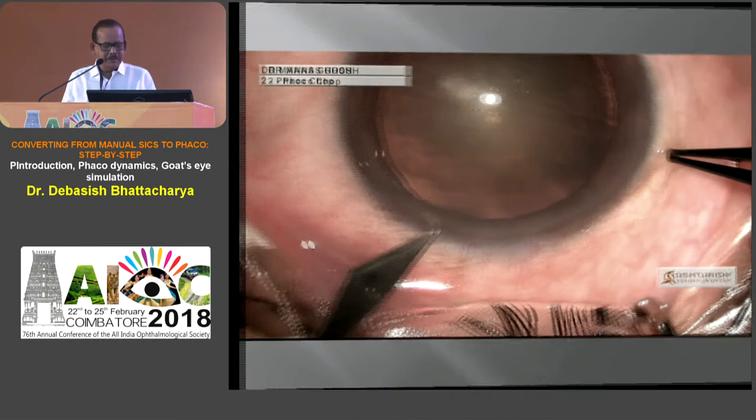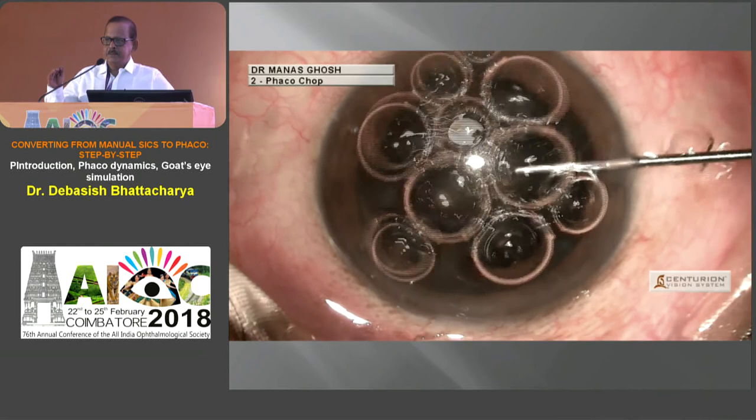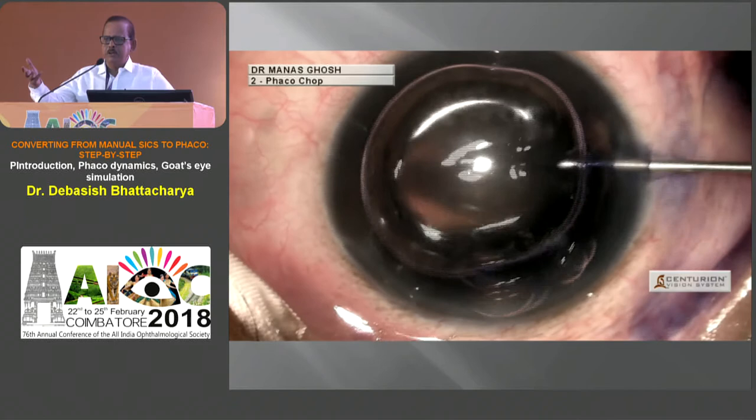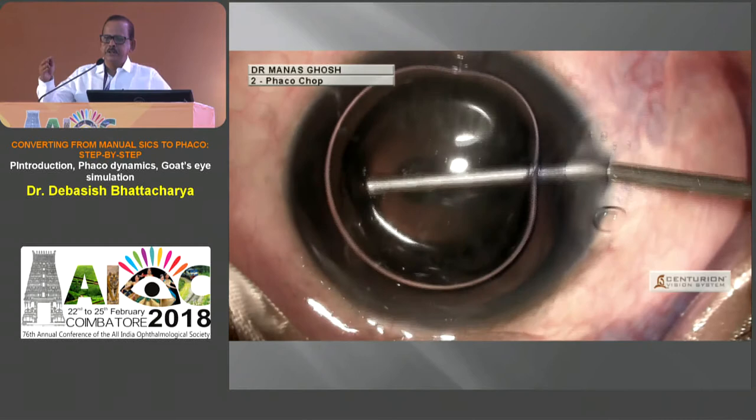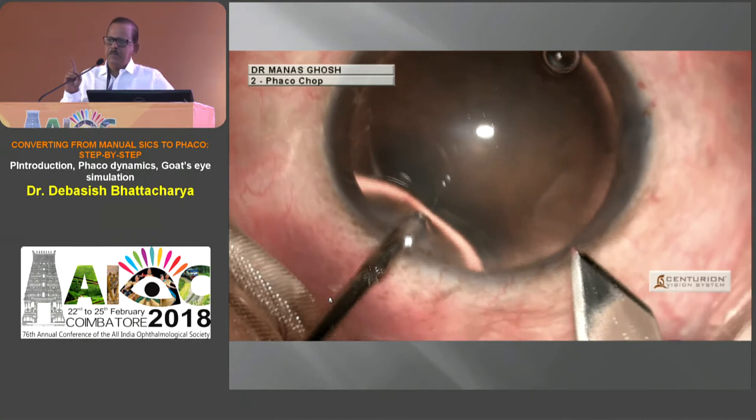Let me take you through the preliminaries of the steps of learning. Initially, do all cases planning SICS in mind — you'll probably be giving a PMMA rigid lens — but try your machine at every time when you're confident from your wet labs. Stain every rexis in your initial cases because in phacoemulsification it becomes very mandatory to see the rexis all the time during the procedure. Few things to remember: the direction of the two ports you've made. One must come into the subincisional cortex and your left-hand port should go towards 5 o'clock, because that is what you'll use to guide and chop the nucleus.